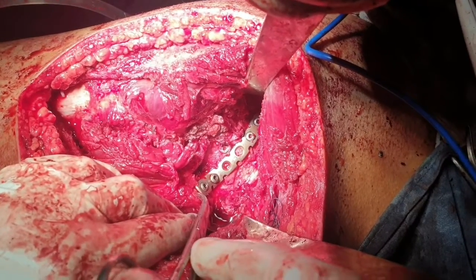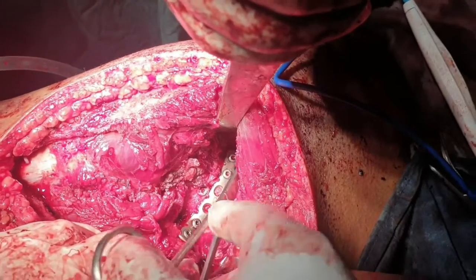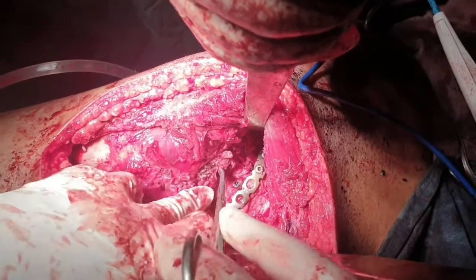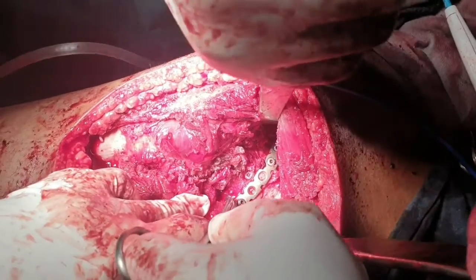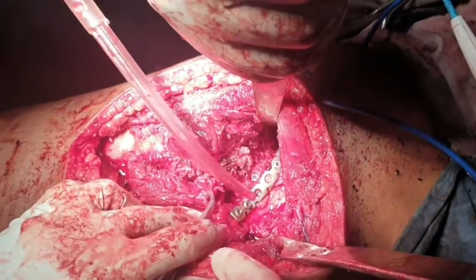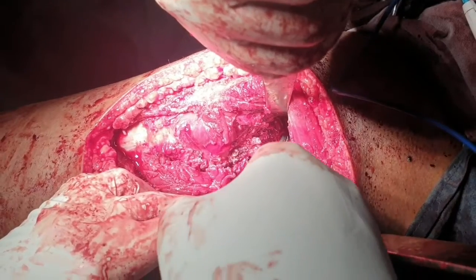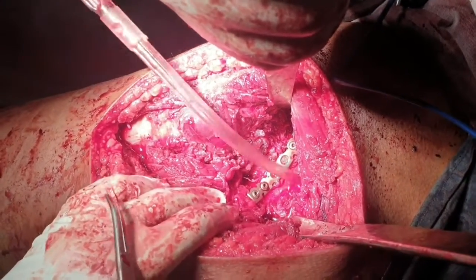Ischial tuberosity inferiorly, two screws posterior superiorly, and one lag screw. So this is a stable fixation of the posterior wall. This is a large fragment starting from here to there, about 6 centimeter. So it must be fixed, and this is about 90% of the posterior wall. So thank you.